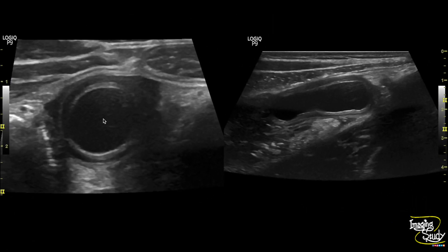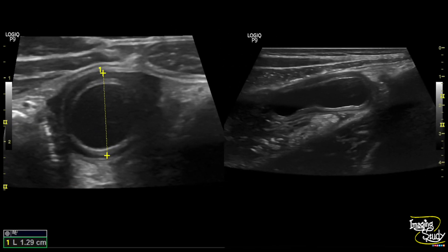This is the transverse and longitudinal section of this appendix, and you can see some collection adjacent to it. The diameter measures around 13 millimeters.